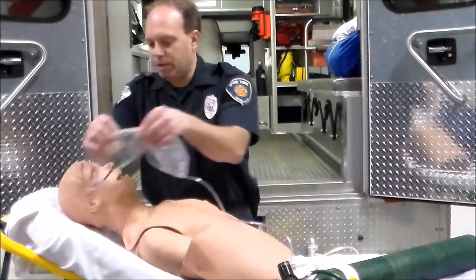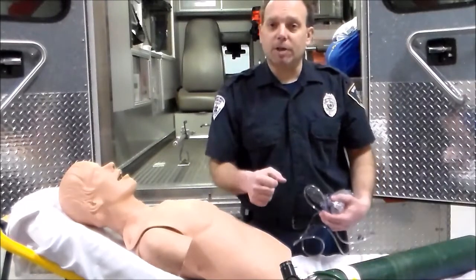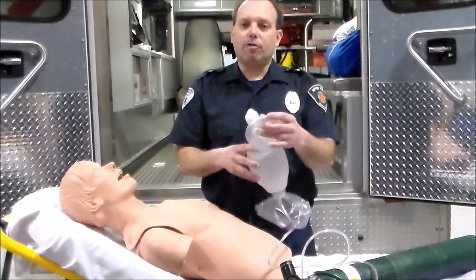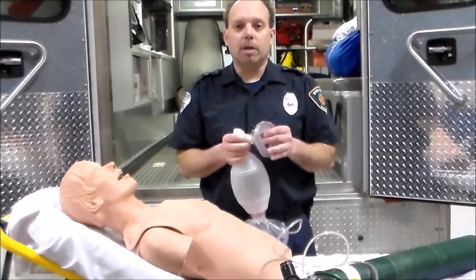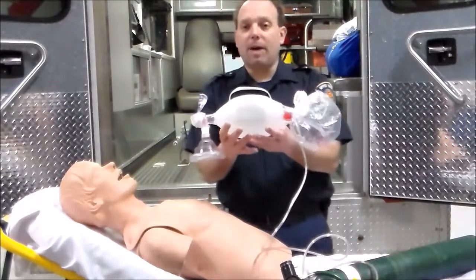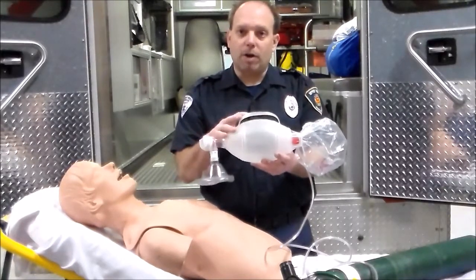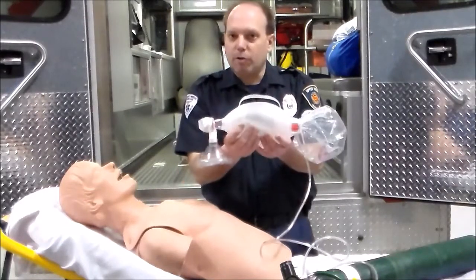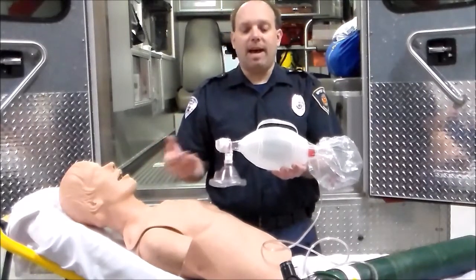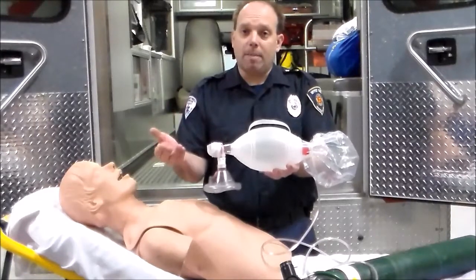Our last device is the bag valve mask, primarily used for patients needing positive pressure ventilation. We administer up to about 95% oxygen while also ensuring we are ventilating the patient. Each bag can deliver about 1,200 milliliters of air. Recall that normal tidal volume is about 500 milliliters per breath, so if you squeeze the whole bag, you're actually hyperinflating — sending more air into the lungs than needed — which can create problems and lead to hyperventilation.